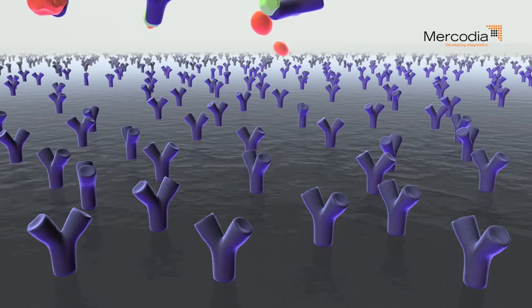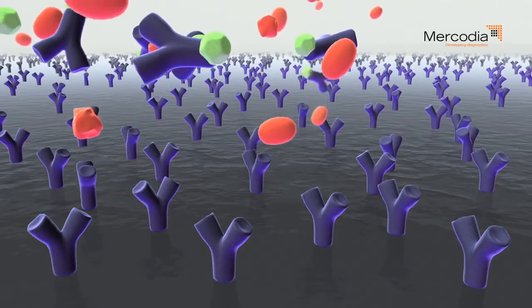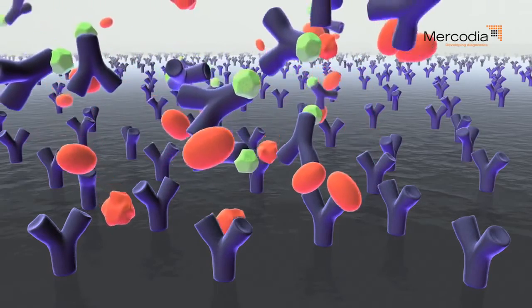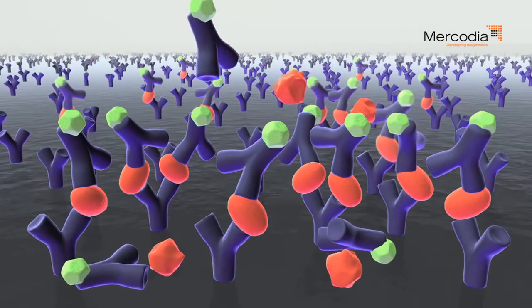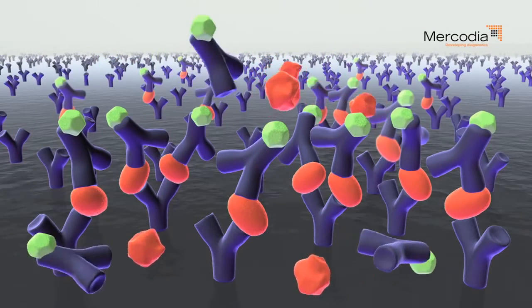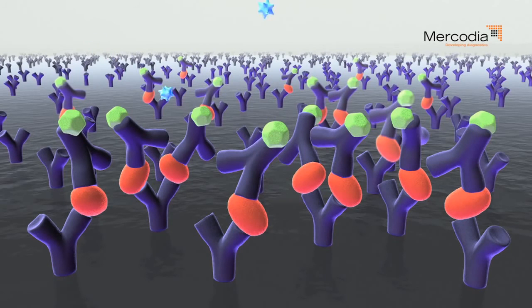The sandwich ELISA may also be constructed as a simultaneous assay where the sample and the detection antibody are added in the same step. After a washing procedure, the substrate is added.